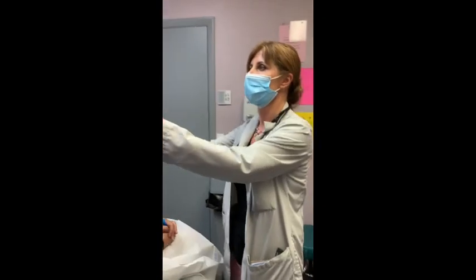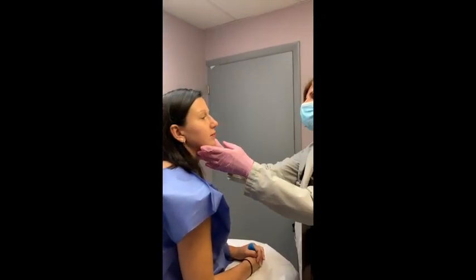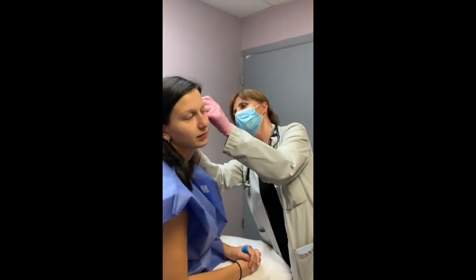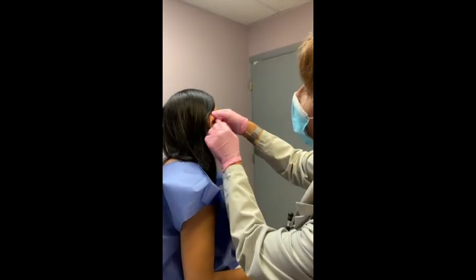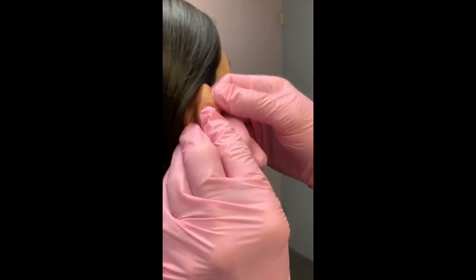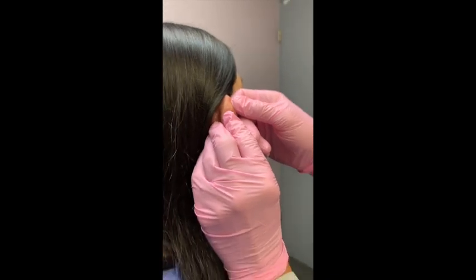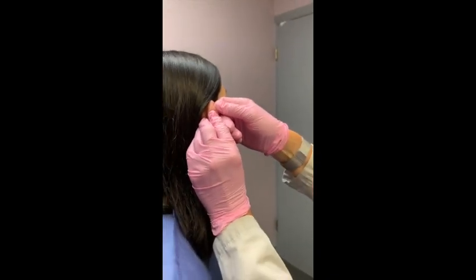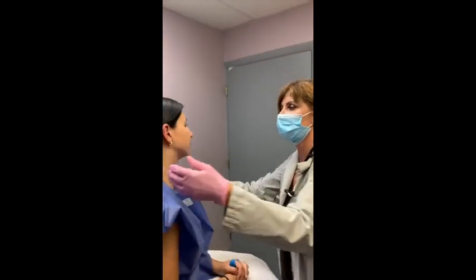Now we're going to look at the skin from top to bottom. First we look at the visible parts — the face, which shows nothing needing attention. I look at the ears and behind the ears. There is one lesion here which is brown, small, symmetrical with a smooth border and most likely hasn't changed — an example of a benign mole that doesn't need excision at this point.